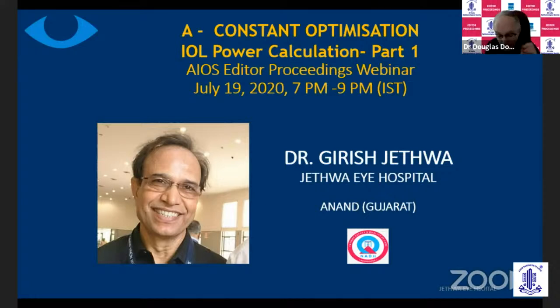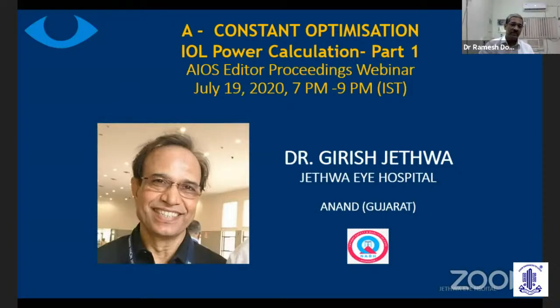Yeah, the one thing we haven't mentioned also is just the error of refraction. And that was pointed out by Norby, that the postoperative refraction that we do, if we're delegating it to a technician who might not be a good refractionist, that throws all the data off. So there are just so many points along the way that errors can be introduced. But I thought that was, again, a great talk. Thanks a lot, Ramesh.